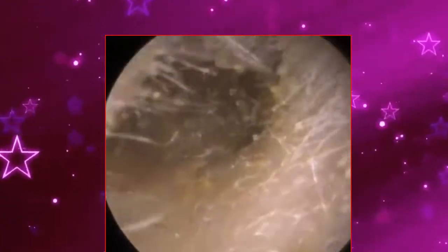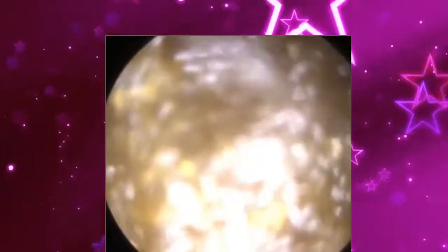The patient just has pure dead skin buildups. Even this wax has got a high composition of dead skin. So what is keratosis obturans? Now, keratosis obturans is a buildup of dead skin that's shed from the ear canal but not migrated out.